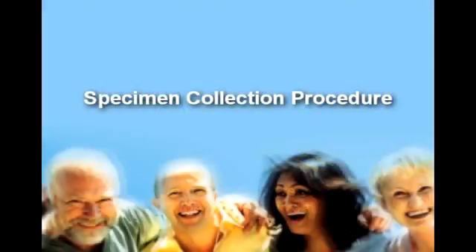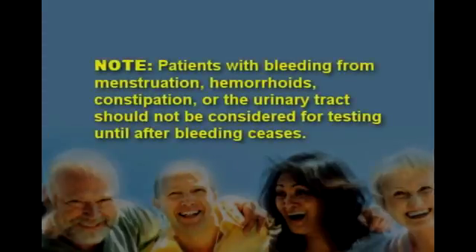The specimen used in this assay is feces. In most cases, the patient will collect the specimen at home. In some cases, the specimen is collected at the physician's office or lab. Note: patients with bleeding from menstruation, hemorrhoids, constipation, or the urinary tract should not be considered for testing until after bleeding ceases.